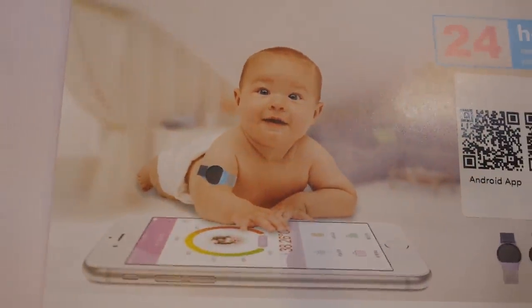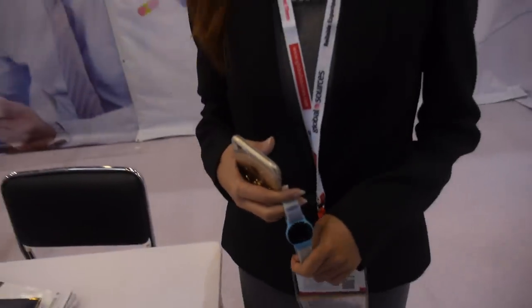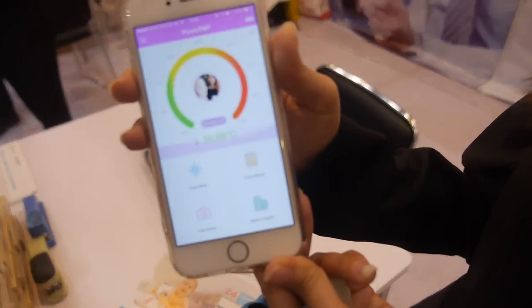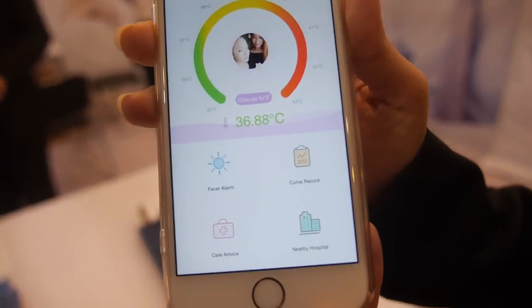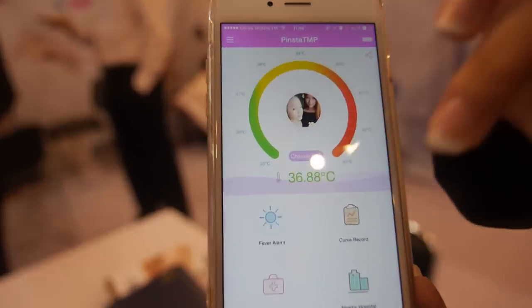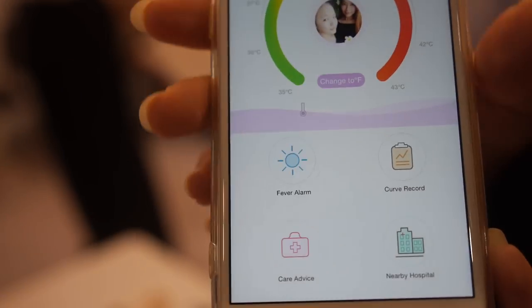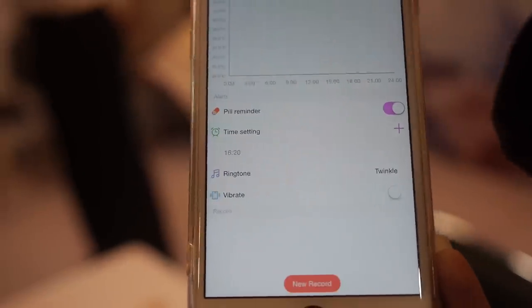It measures and checks the baby's temperature. Can we see the app? Yes, the app is like this and you can see the functions. You can make the baby's temperature reading go higher, and it keeps a record inside.